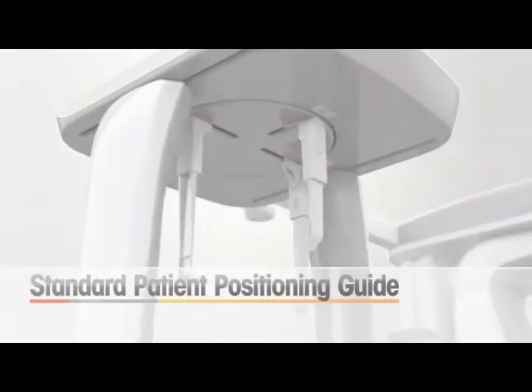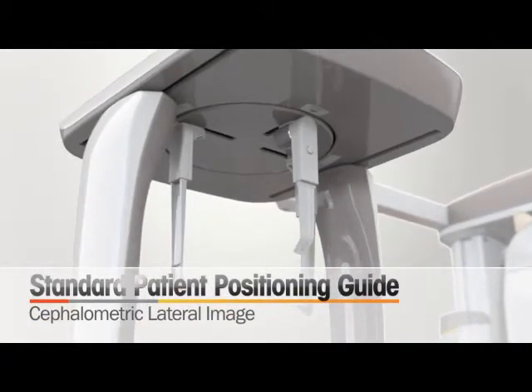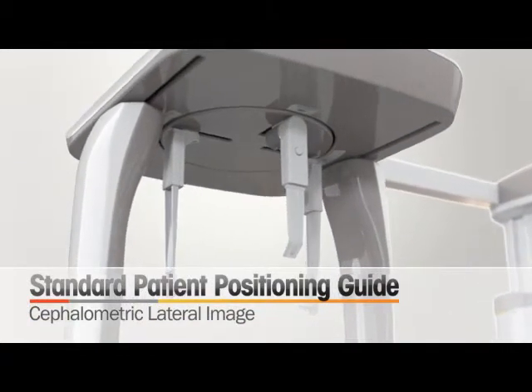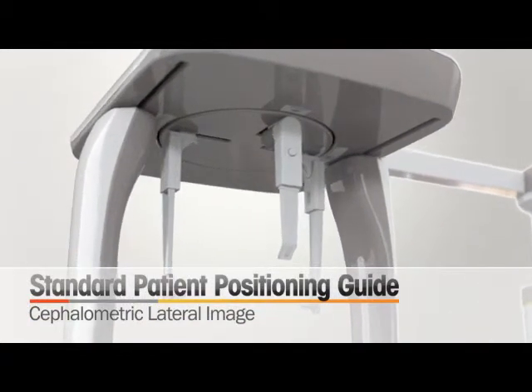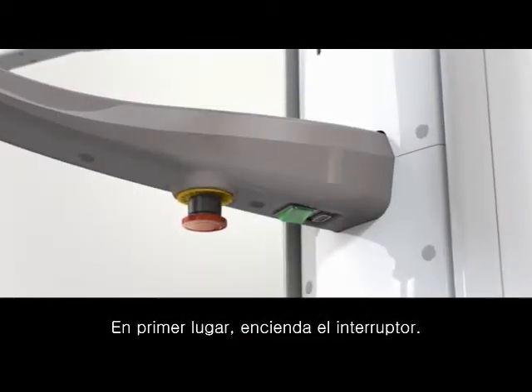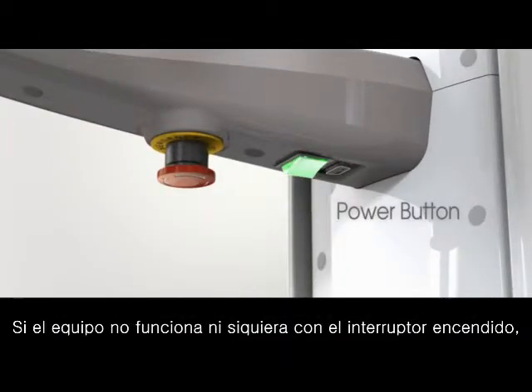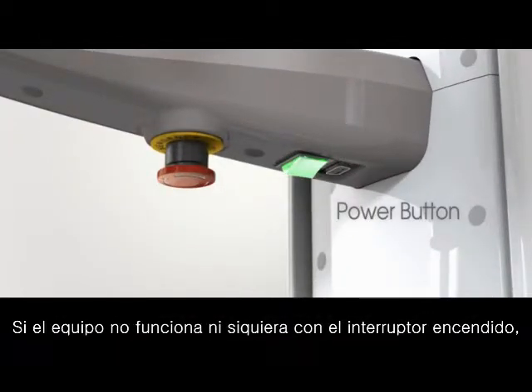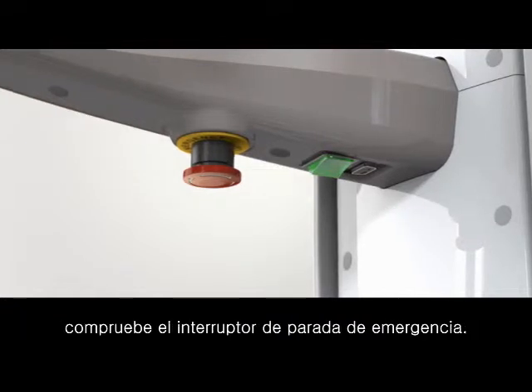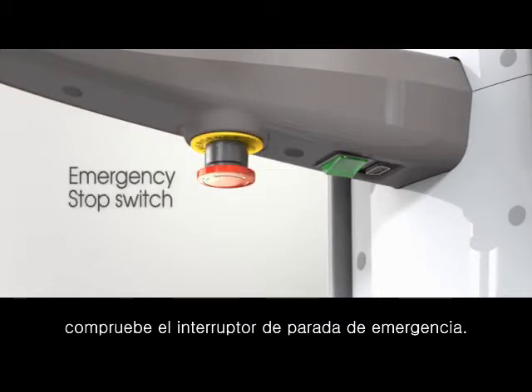We start the standard patient positioning guide for cephalometric lateral image. First, please turn on the switch. If the machine is not working although the switch is on, please check the emergency shutdown switch.